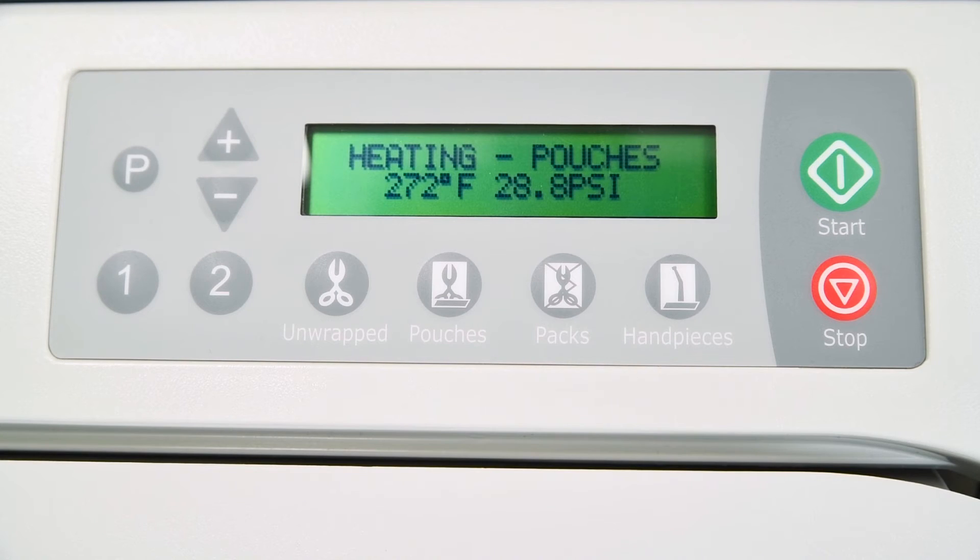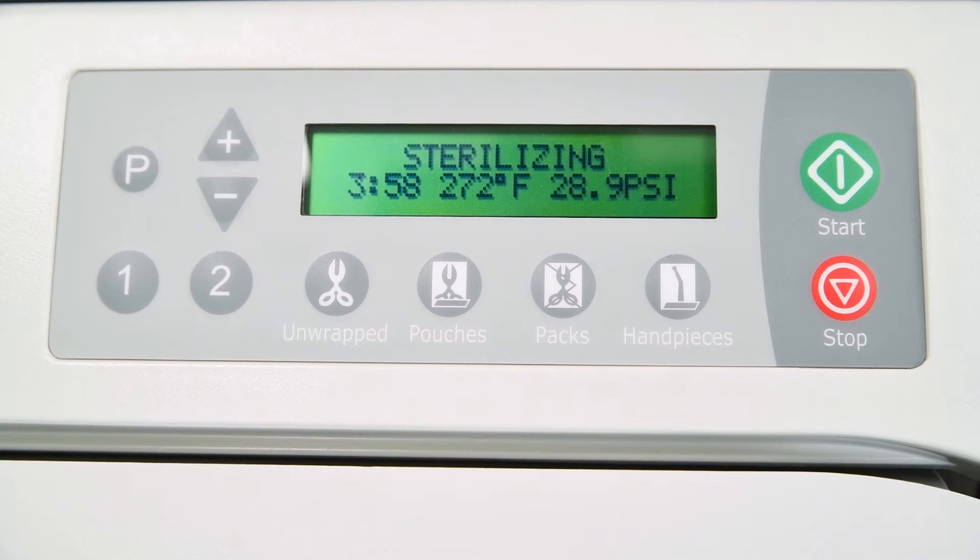Once the appropriate sterilizing temperature is reached, the display shows the time countdown and monitors the temperature and pressure. During sterilization mode, the heater will cycle on and off. Just prior to the end of the sterilization cycle, ready to vent will display for 10 seconds, then the vent cycle will begin.